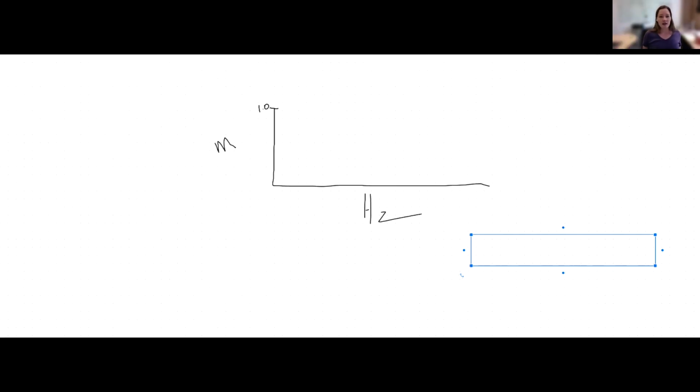So you need to know something about your signal and what kinds of things you're trying to filter out and keep in your signal. So what do we want to keep in? Common sources of noise we've mentioned are motion, 60 hertz electrical, radio, and ultrasound.